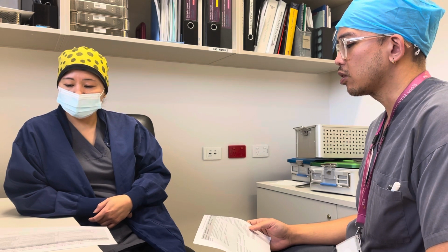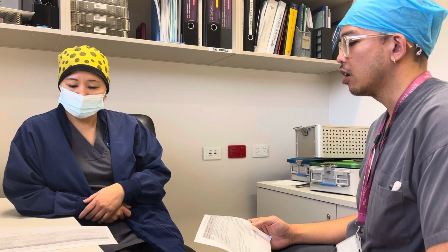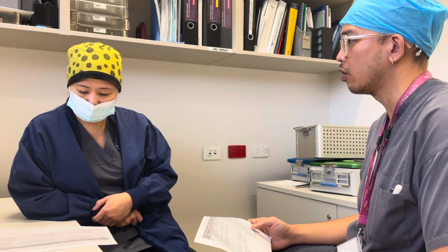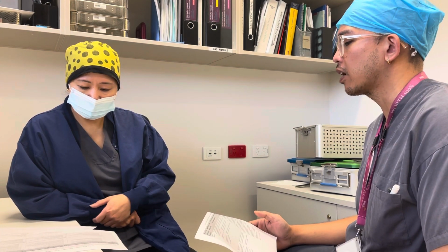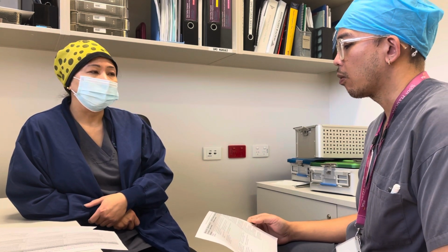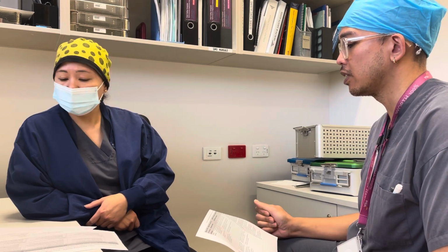The standard is also used so that the HSO can better define and refine its own practices through the standard's compliance procedures and requirements on management. So while the standard itself is merely a guideline for best practice, certain rules and regulations and procedures within it relate to certain legislation found in both Australia and New Zealand.